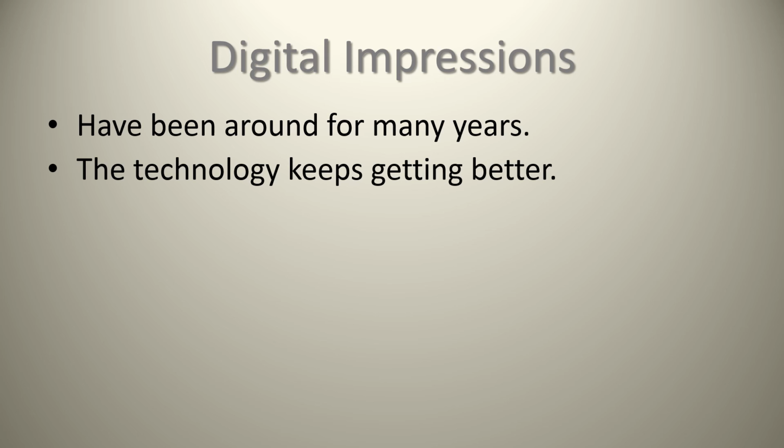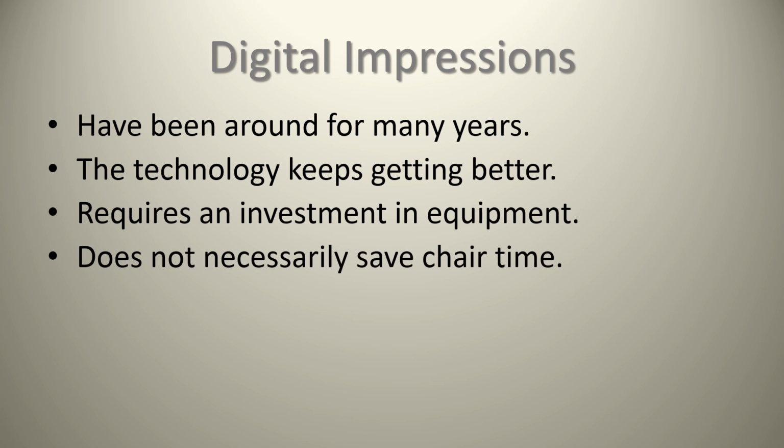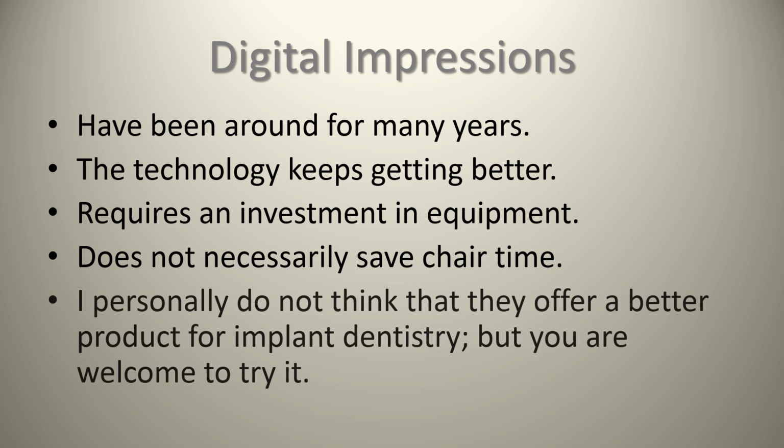So I'm not quite sure what the purpose of digital impressions is, or who quite benefits from it, whether it just be the company or the labs who don't have to necessarily deal with paying for as many shipping costs and stuff. However, they do have a place in the market, so we'll talk about that. So it does require an investment in equipment on your part, and it doesn't necessarily save chair time is another thing you have to consider. I personally do not think that they offer a better product for implant dentistry, but as I mentioned, you're welcome to try it.